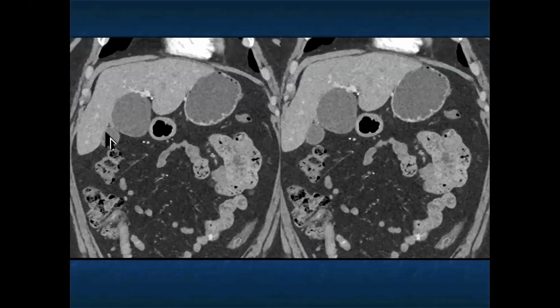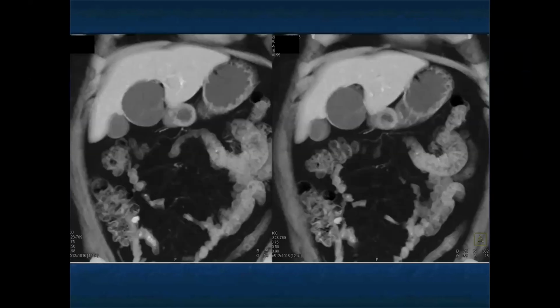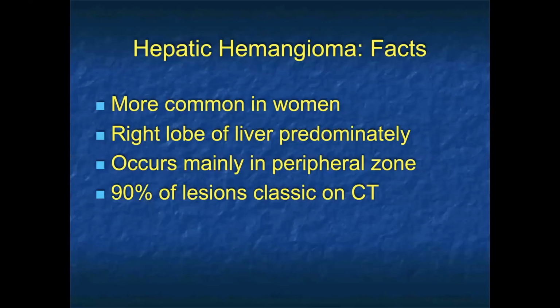Again, I showed this in conference. Someone said duplication of the gallbladder. Okay, duplication of the gallbladder does occur, but that's not the diagnosis in this patient. I do find that as you go to 3D imaging with volume type displays, you can accentuate things like septations more. I think when you have a single thin axial slice, it's a bit tricky at times. Coronals are a bit easier, but the volume display is even better.